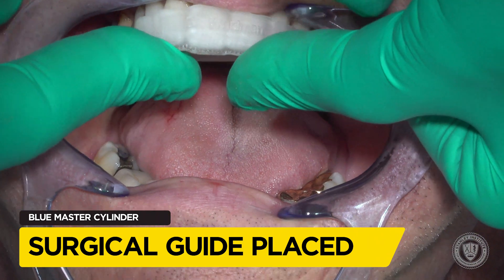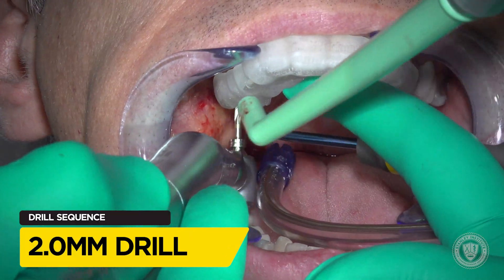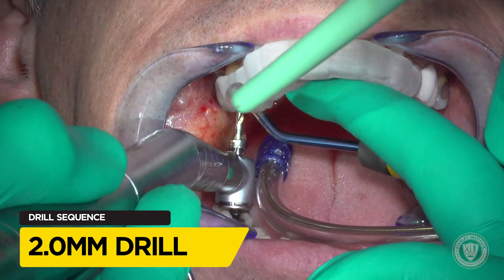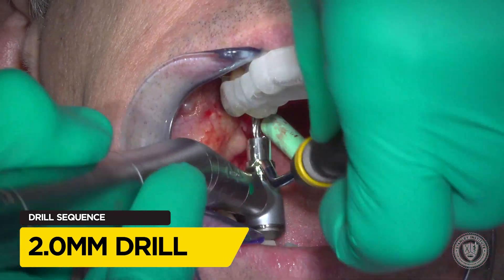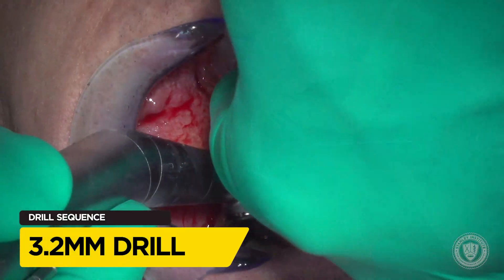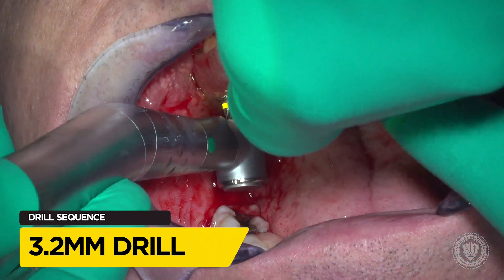We've got our surgical guide ready to go — it's a blue master cylinder with blue guide sleeves, according to the BioHorizons guided kit. We start with a 2-0 drill and step through our drilling protocols, getting wider in diameter while keeping the drill length the same.